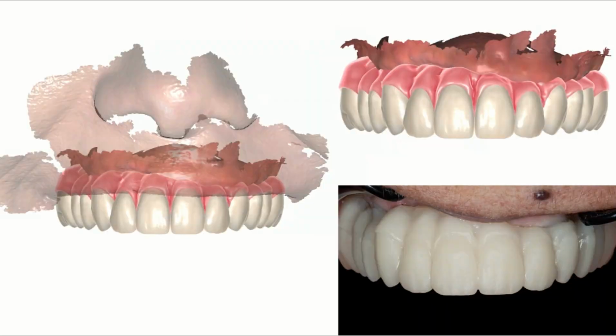So we made a face scan with our Oral Scan 3. Of course, at the time, Metasmile was not produced yet, and we readjusted our work in the correct orientation to manage the cant. Look now at the case. The full arch restoration will be FP3 on the right side and FP2 on the left side. So the lab can manage the cant after we supply them with the extra information, which is the face scan.